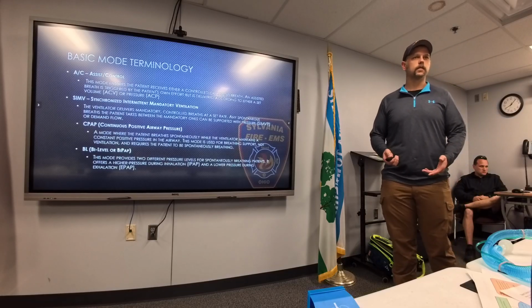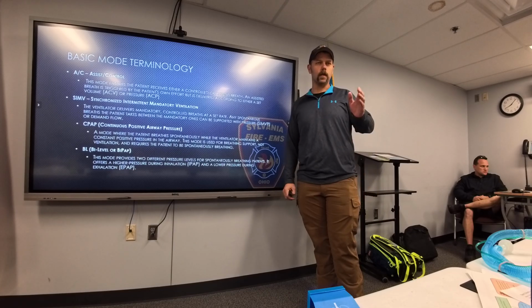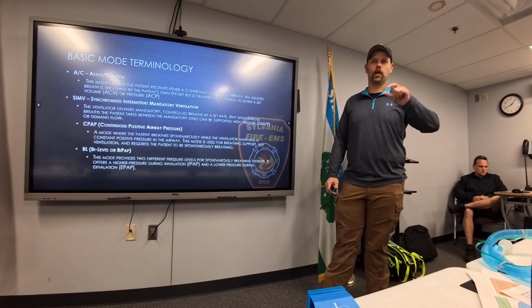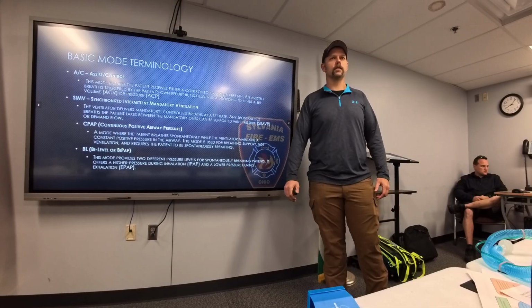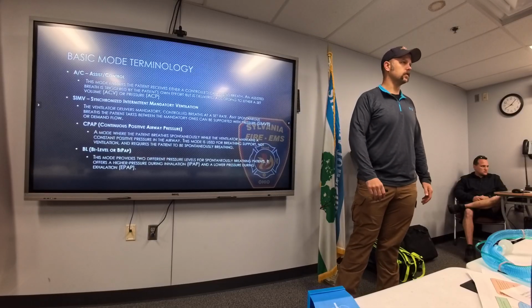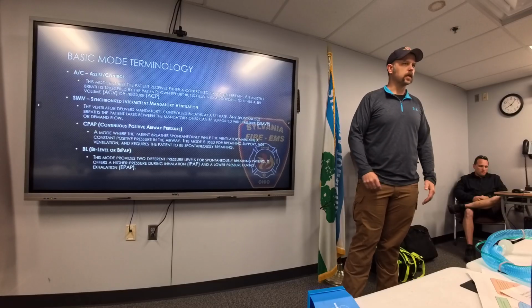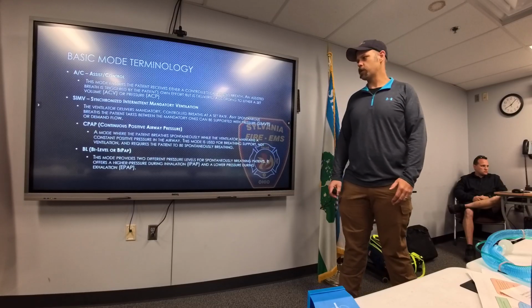What does that mean for us? Not a whole lot. Here, our vents are set up in assist control. So if we intubate somebody, we're going to put them on assist control. That's under our adult setting. Other than that, don't read too much into it, because that's a whole lot of stuff that Kelly would use in the hospital as far as pressure modes, volume modes, things that don't really concern us in our short period of transport times. CPAP, continuous positive airway pressure.